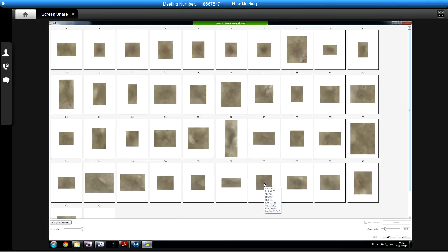So maybe if we look through, which ones are trees? So these I'd say are all tree positives, aren't they? So that's like 46, 56, 47, 60, 60, 42. So everything so far is between about 40 and 60. What about that? No. No. That's a tree, I'd say, isn't it?